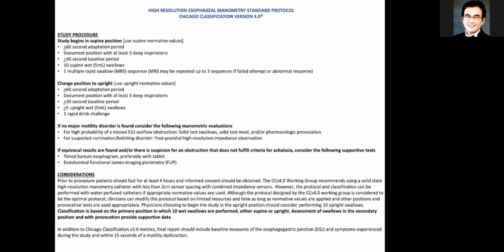So some of us may not be familiar with this, then I think it's time to incorporate this particular provocative test into our protocol, other than MRS. In our unit, we've been doing MRS for all patients, and we are starting to also incorporate rapid drink challenge.